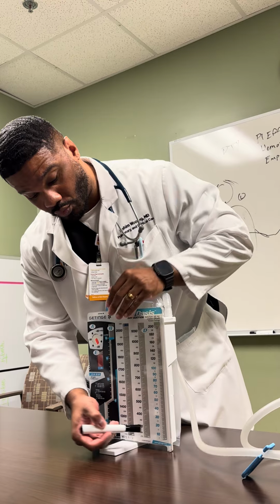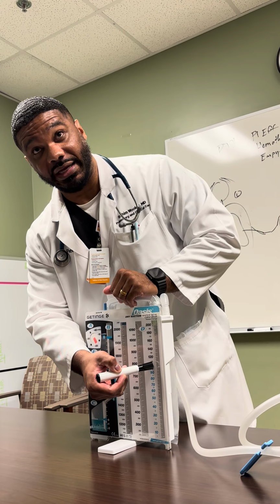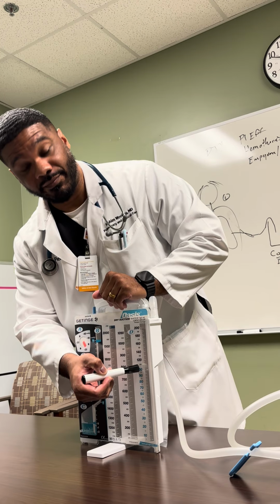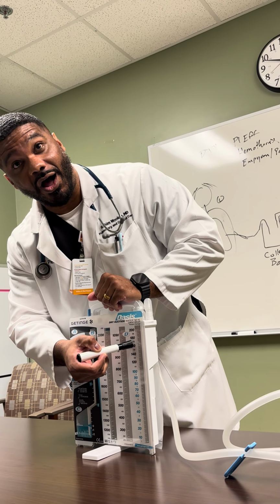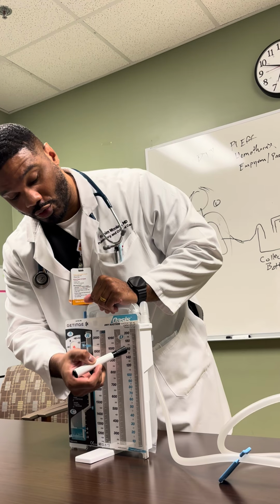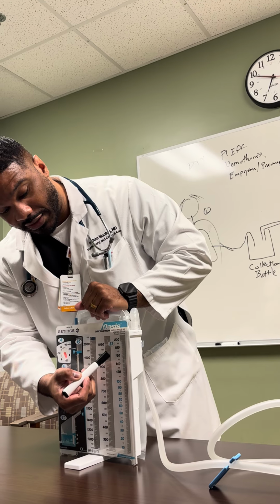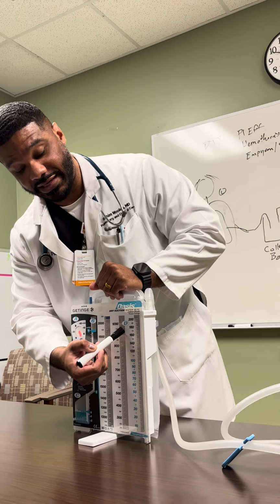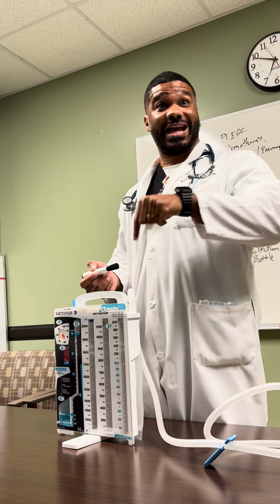So for instance, when we first place the chest tube, if we drain 100 out initially, okay, and then at the end of the shift, we get 100, and then at the end of the second shift, we have the levels at 160. It would be helpful if you dated, timed, and put 60 mLs, okay? 60 mLs, because that would dictate how much we drain during that shift.